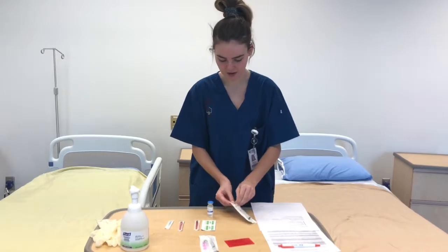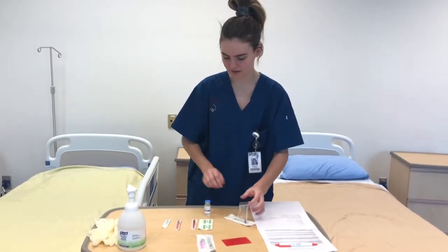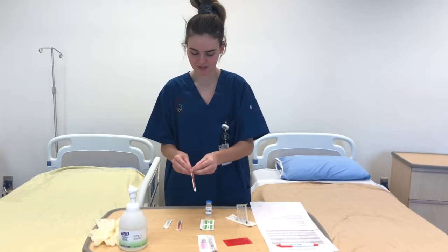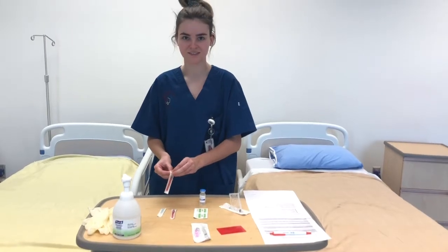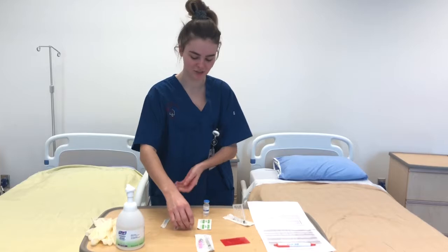So I'm going to open it up and take it out, and then open up my needle. And this is a blunt tip needle, and we are using this one to puncture a site in the vial, so it won't be damaged when giving the injection to the patient.